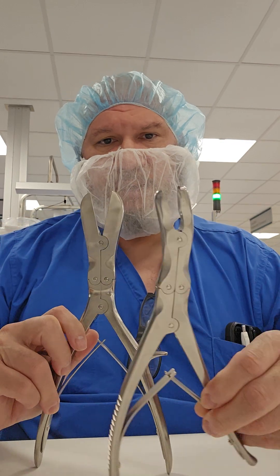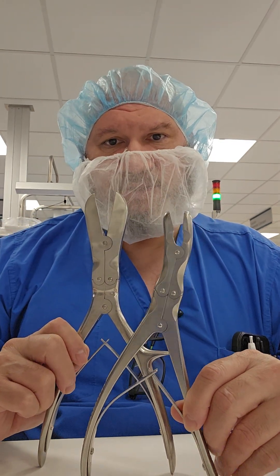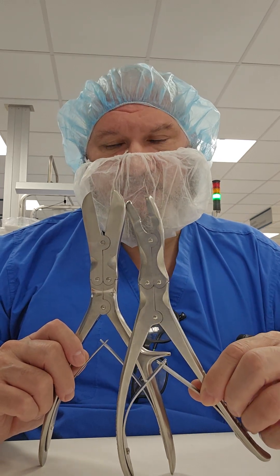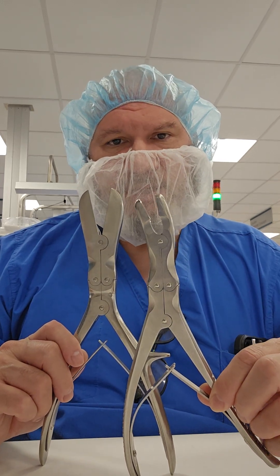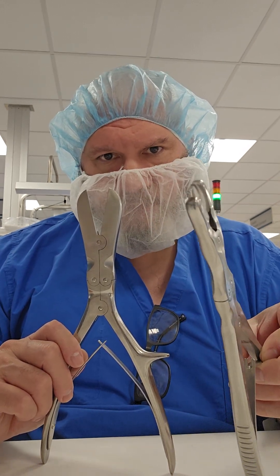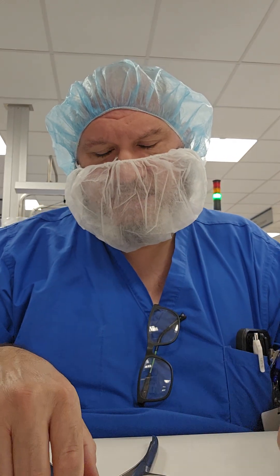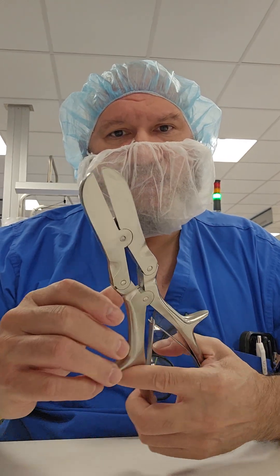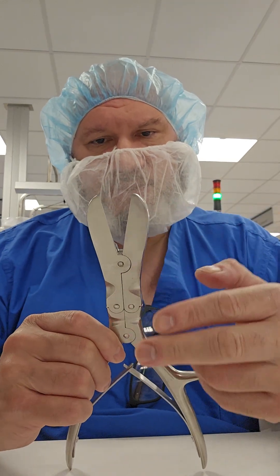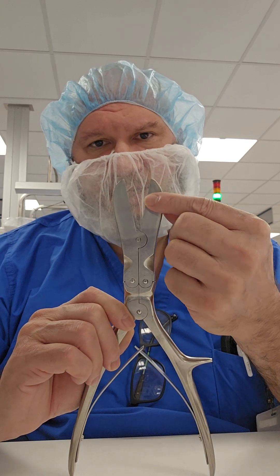At a quick glance these instruments have some very similar features — they're both used for cutting, but for different purposes. The rongeur takes bites and chunks off with the cup of the jaw, while the Liston bone cutter slices through the bone completely with a heavier jaw and cutting-edge blades.